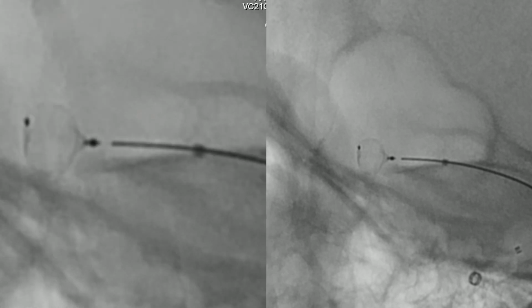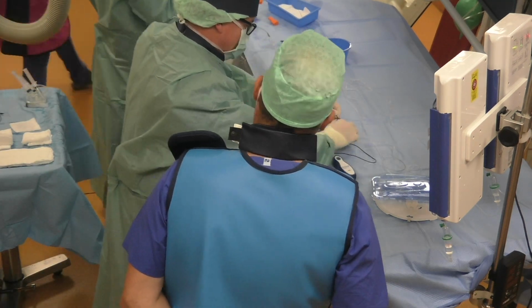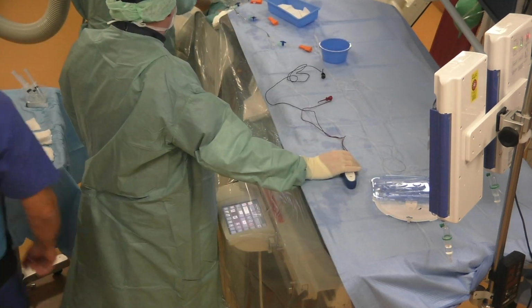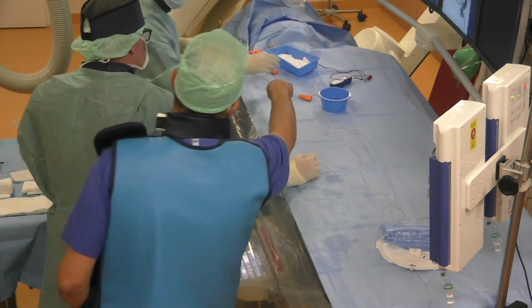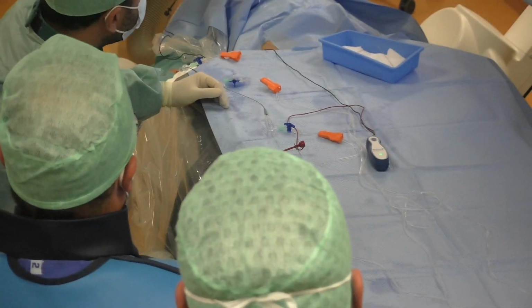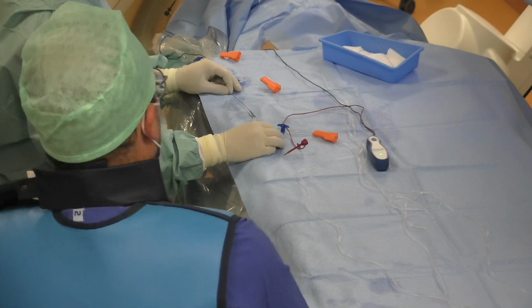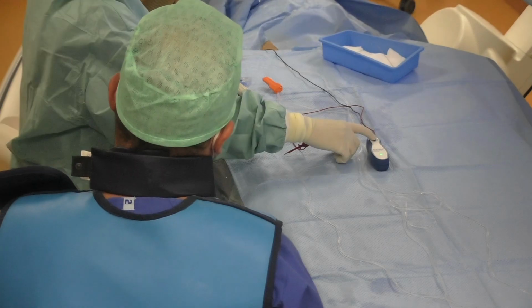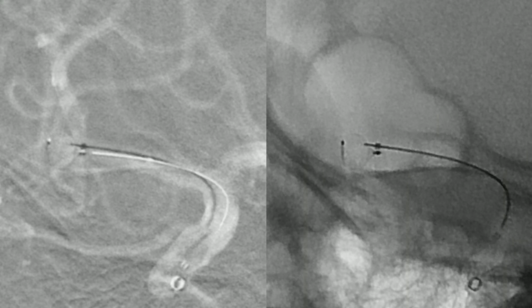And now, after we've made sure that everything is okay, we can detach the device from the pusher, and we take the detachment device. It has 2 cables. The black cable will be attached to the patient on the shoulder of the patient, and the red wire will be attached to the pusher of the device. We activate the device and push the microcatheter a little bit forward to get a stable position, and now we can activate the detachment. And the pusher jumps a little bit, confirming the detachment.